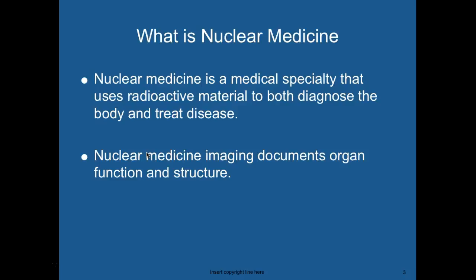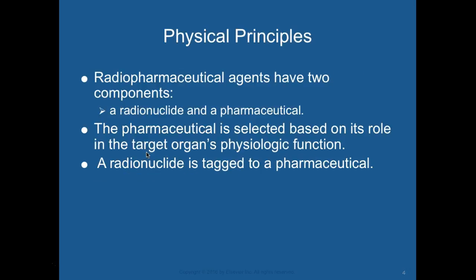the body. So nuclear medicine is imaging, documents, organ, function, and structure. So we can look at the actual function of the organ along with the structure using nuclear medicine and radioactive isotopes. So the principles, we use a radiopharmaceutical.